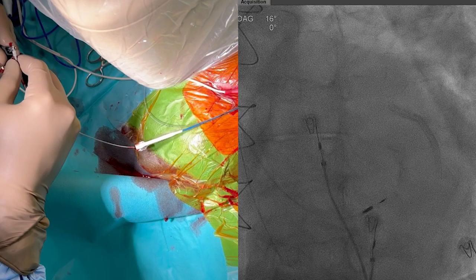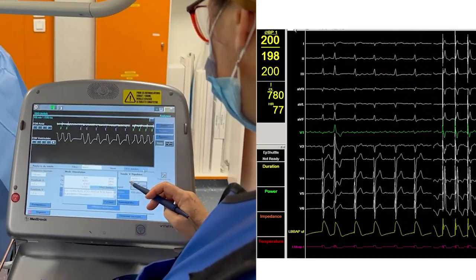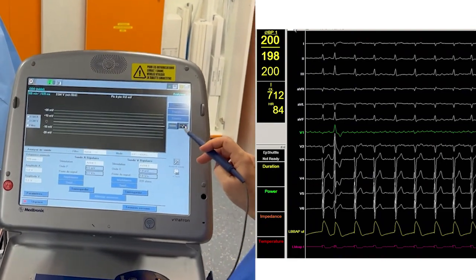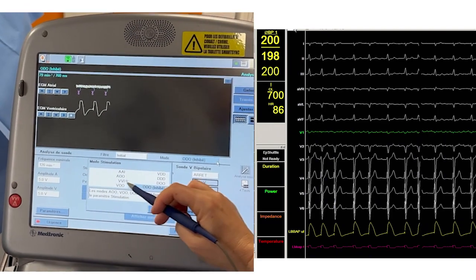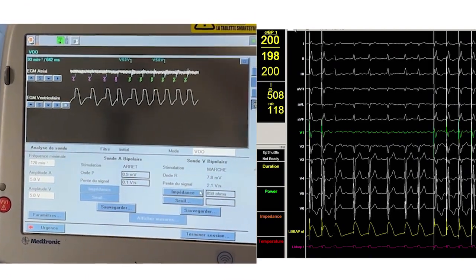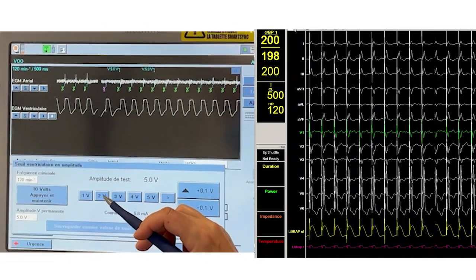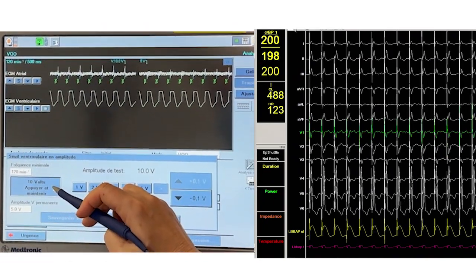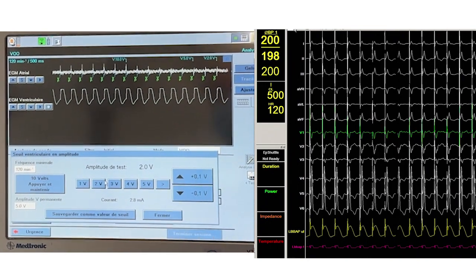The lead is reconnected to the programmer, always in unipolar setup. The lead adequately senses the irregular ventricular rhythm. An injury current on the distal tip should be present together with R waves. Impedance should be relatively high, associated with septal myocardium.